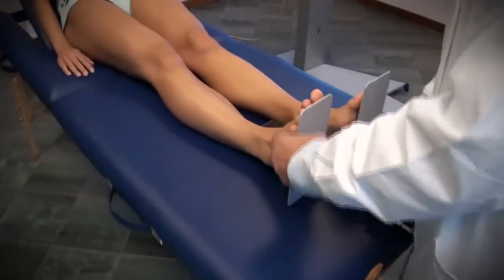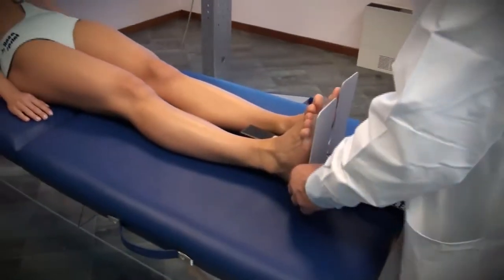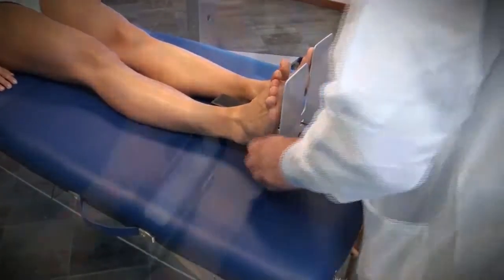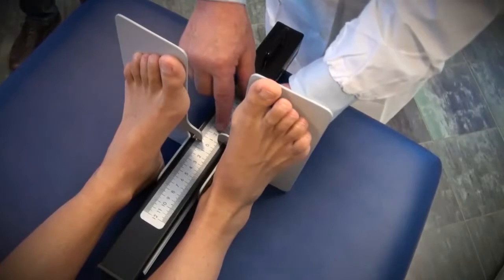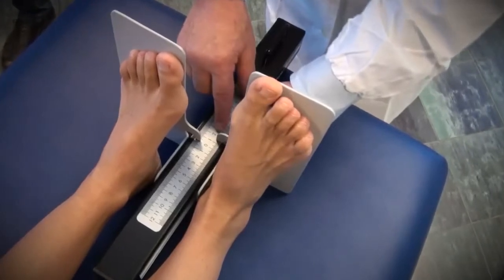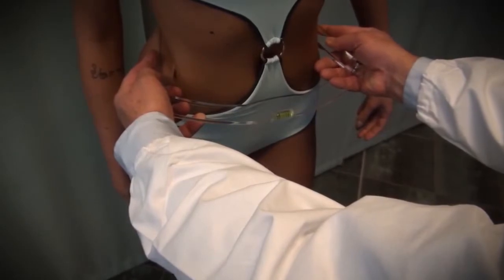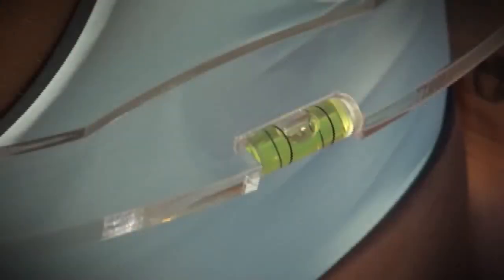The patient's posture can also be examined using other instruments. We begin with the delta leg and find that the left leg is shorter by 1.5 cm. We can do the same check-up using an analyzer with shims, and we still find that the left leg differs by 1.5 cm.